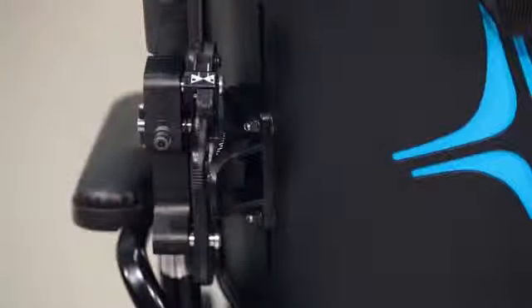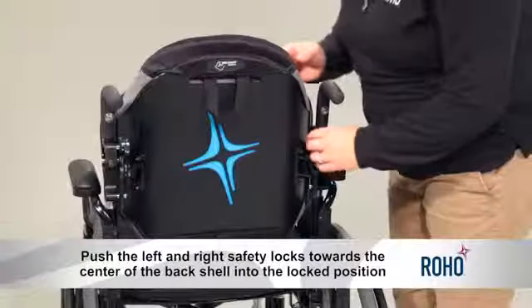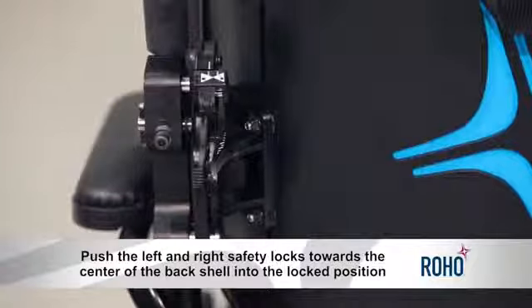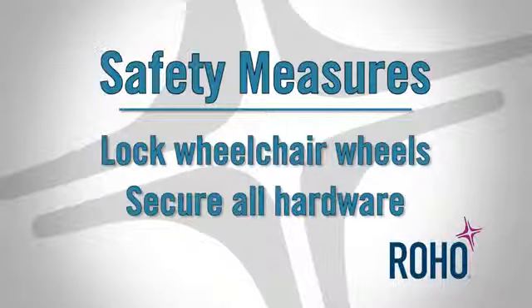Continue to pull the backrest over the top pins, allowing the curved latch to ride up and over the upper pin. Push down on the back shell to ensure the back latches are in place. Make sure both the latches are fully closed. Lock the latches by pushing both the left and right safety locks toward the center of the back shell into the locked position. Make sure the wheelchair wheels are locked and the Agility safety locks are in the locked position, and all hardware is tight before the individual is seated in the chair.